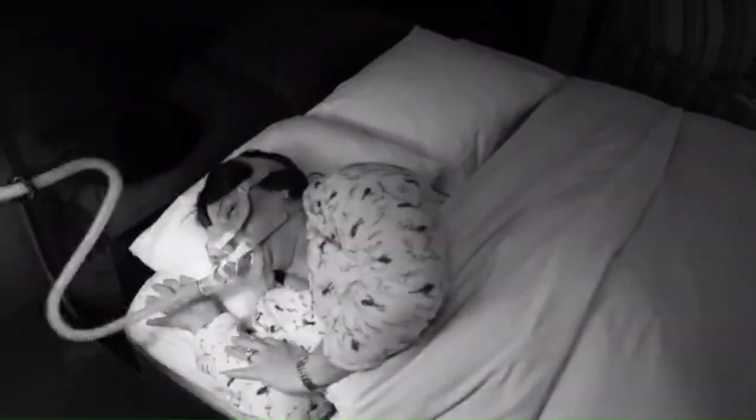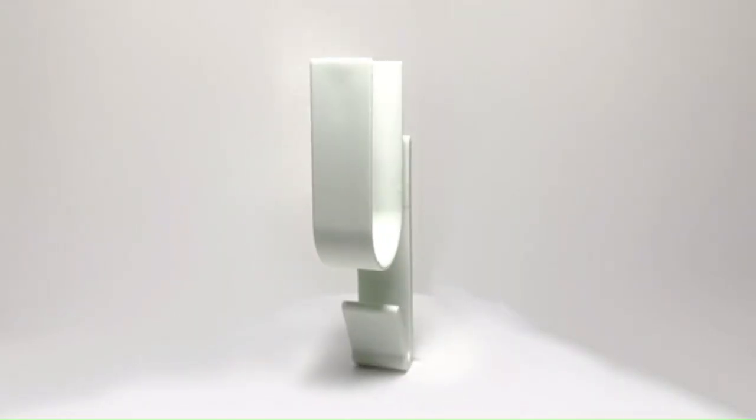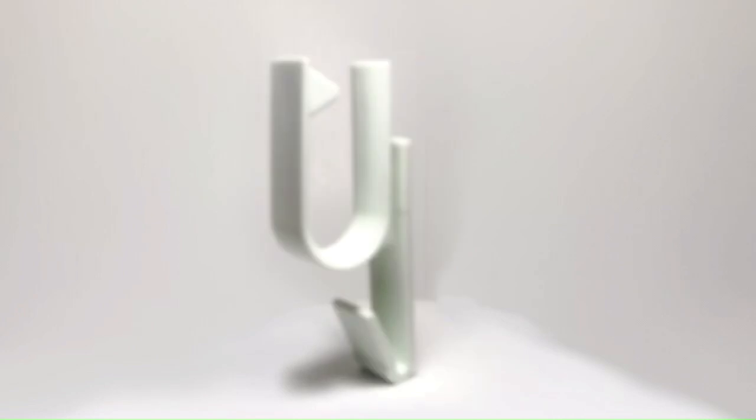Are you tired of waking up in the middle of the night because of the hose from your CPAP machine? Or your current hose accessories just aren't cutting it? Well, the original CPAP hose holder is just what you need.